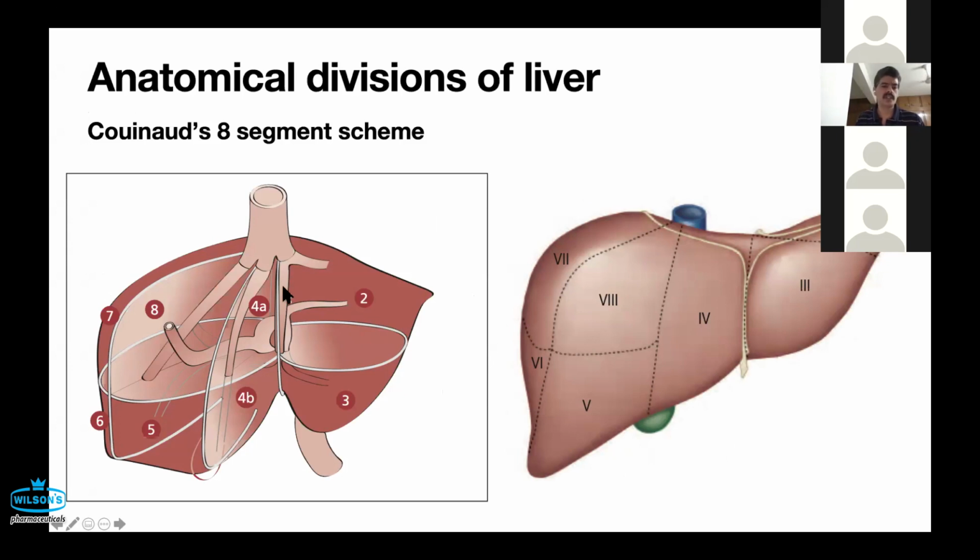Fair enough. So this is the left hepatic vein, which defines the left portal scissura, the middle hepatic vein, which defines the main portal scissura. And the middle hepatic vein actually corresponds to what is called the Cantlie line. Now, please remember your anatomy that the Cantlie line runs from the middle of the gallbladder bed to the middle of the IVC and is the demarcation between the right lobe and the left lobe. So this is the main portal scissura, which also corresponds to the gallbladder, because you are going to see the gallbladder on ultrasound and on EUS. And this corresponds to the middle hepatic vein, which you will see on EUS in the gallbladder bed, which also corresponds to the Cantlie line.